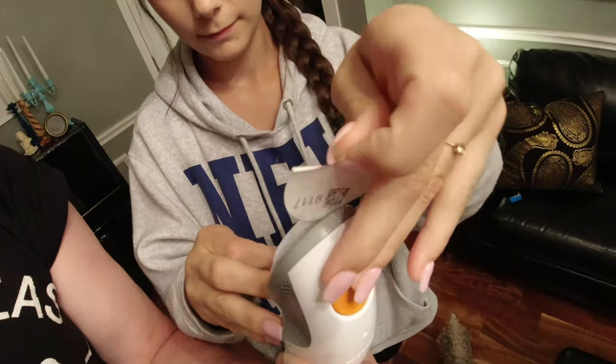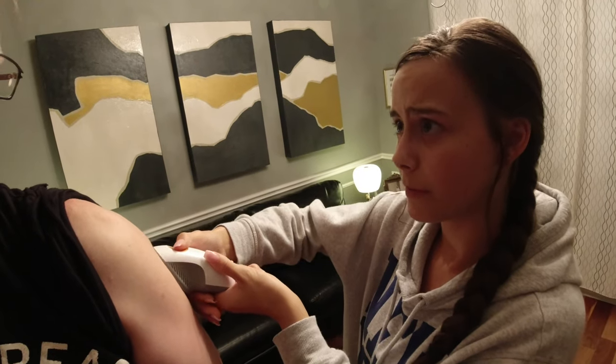This is my assistant Sydney. You never want to forget the code — the code is very important. Push down, just push that orange button. Is that going to poke you? Yeah, but it'll be fine.